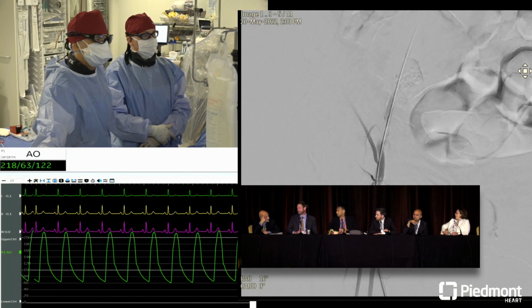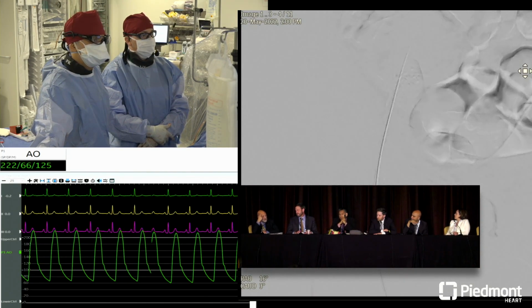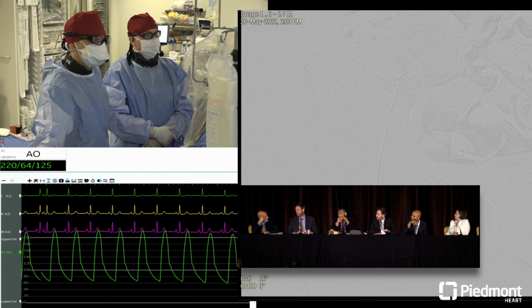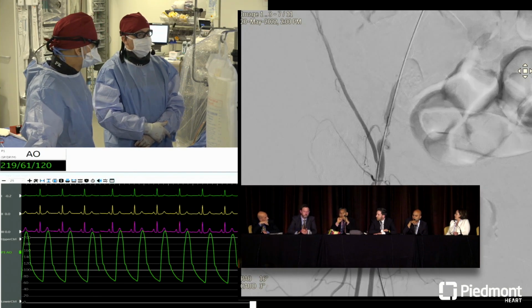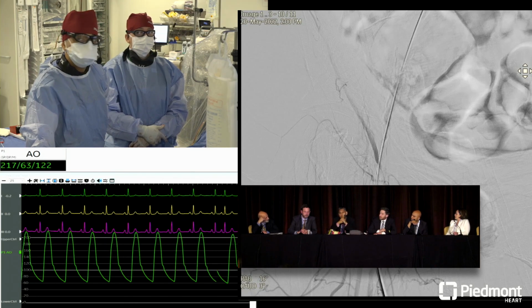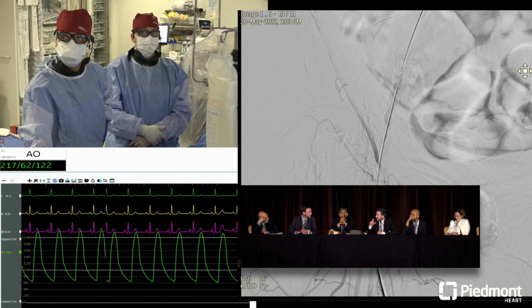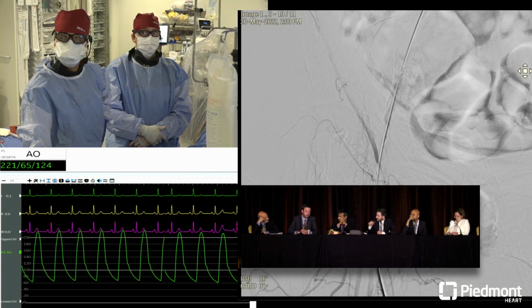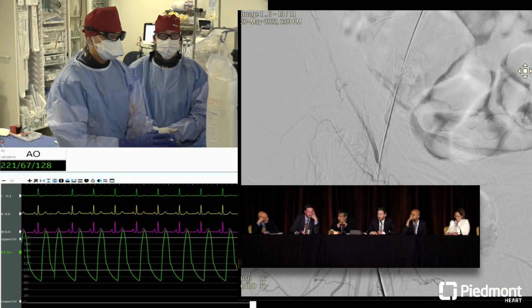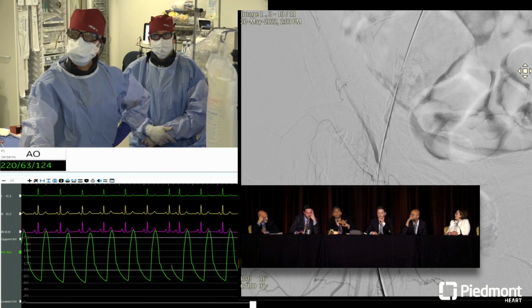The reason I ask is because I've always used, by and large, balloon expandable stents, except for the centimeter or two above the common femoral head, the head of the femur. And what do you do there? I've actually really been pleased with the balloon expandable versions. Yeah, I'll tell you, when you stent that close to the external iliac to common femoral junction, though, there's a lot of compression that happens there. I don't know if you guys have run into this where you can get some distal stent compression. And that always worries me when you get that far down. Like I said, a couple of centimeters above the top of the femoral head. Yeah, so you stay away from that.